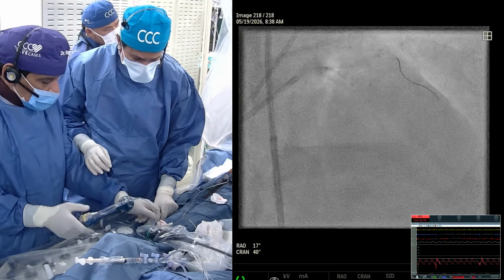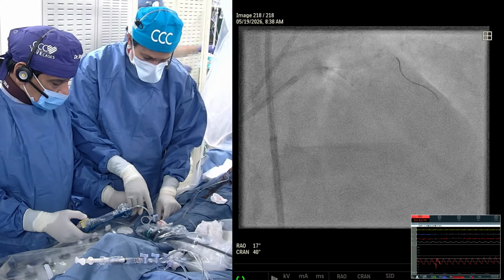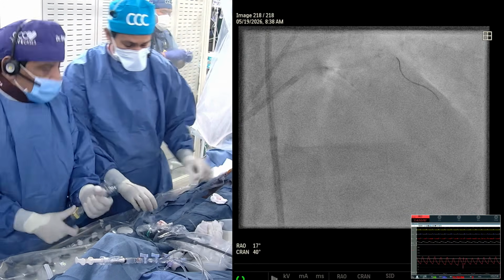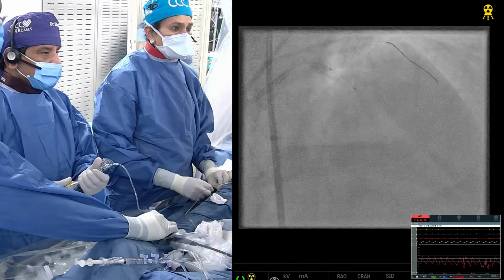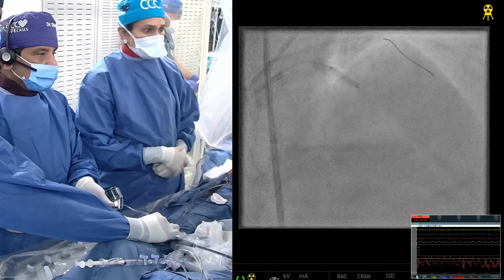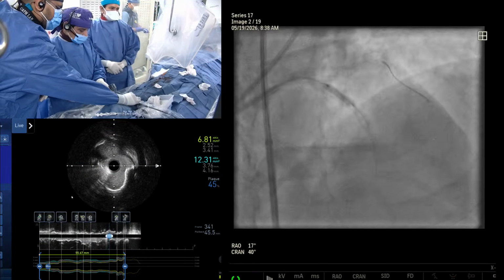Wait, one second, wait. Yeah, I know, the air bubble has to come out. We used to call it burping. The balloon burped. Okay, good. Now we are going to go to 4. Ready? Go up. Good. It will be interesting to see the cracks now.